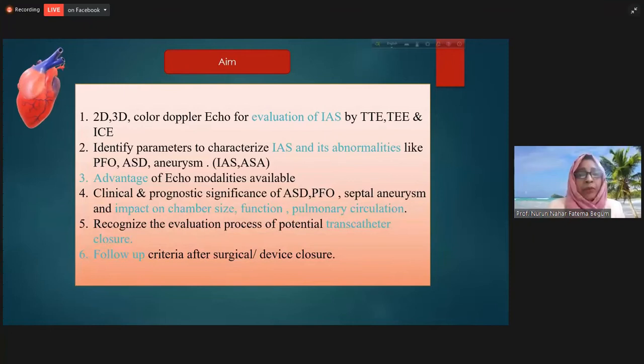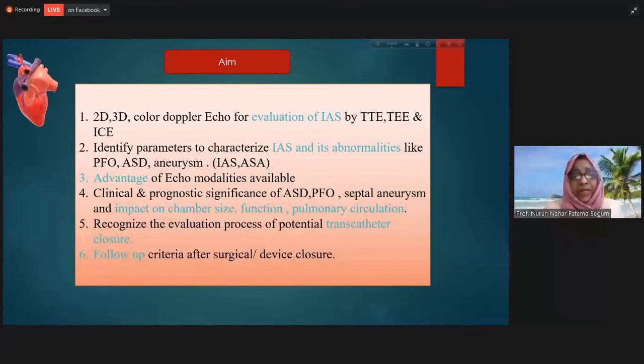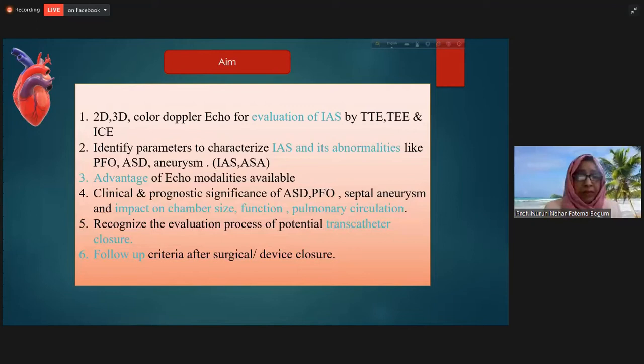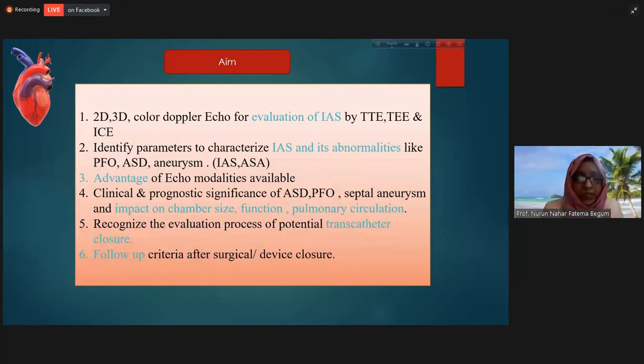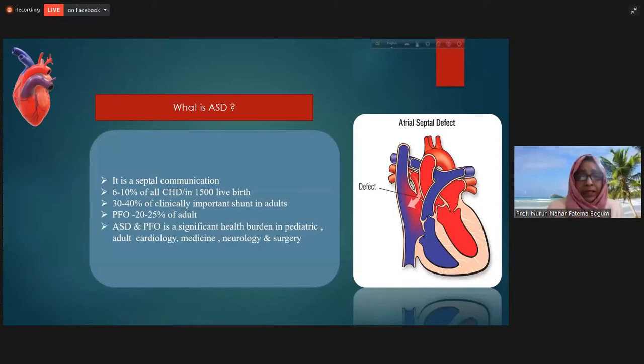Our aim today is to know about the inter-atrial septum by transthoracic, transesophageal echocardiography, and also by ICE. We will identify the parameters to characterize the inter-atrial septum and its abnormalities — like patent foramen ovale, atrial septal aneurysm, atrial septal defect — and discuss the advantages of the echo modalities currently available, their clinical and prognostic significance, especially the evaluation of ASD during transcatheter device closure, and how to do follow-up.